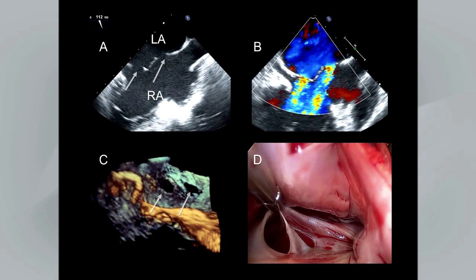3D echo also allows quick recognition of multiple defects. This patient has a multi-fenestrated interatrial septum — an atrial septal aneurysm with multiple communications, Swiss cheese if you will. On 2D imaging we can see multiple defects and multiple color Doppler jets from left to right. When we process the 3D images, we see the interatrial septum with multiple defects — exactly what was seen when the patient went for minimally invasive surgery to close these defects. A mobile Chiari network is also nicely demonstrated.